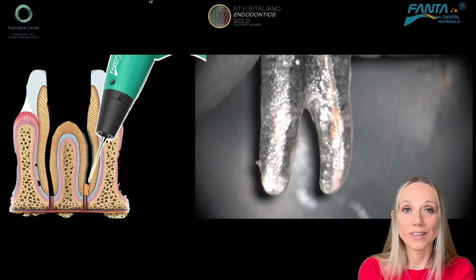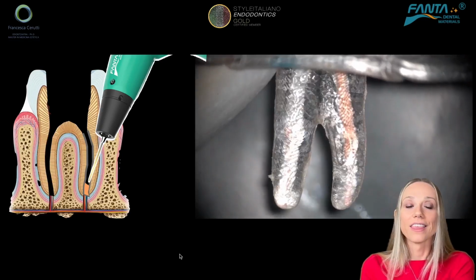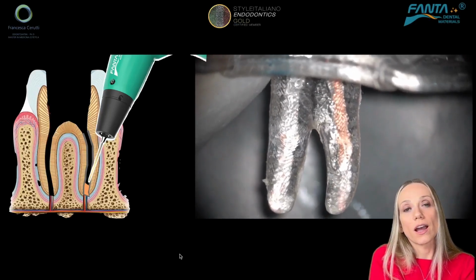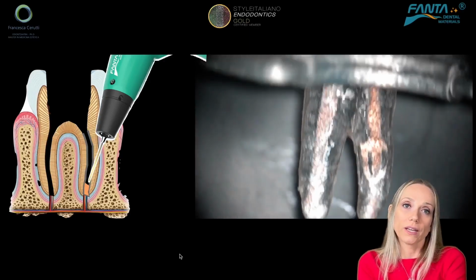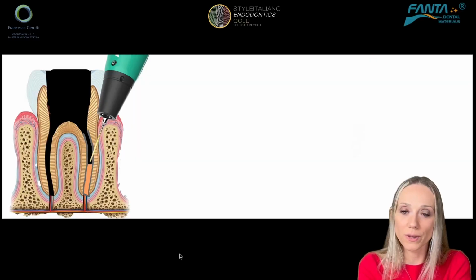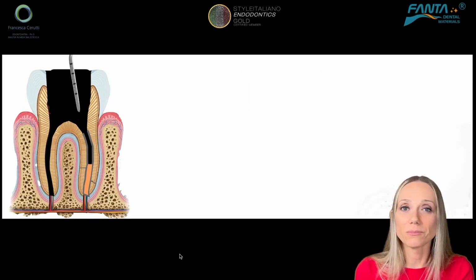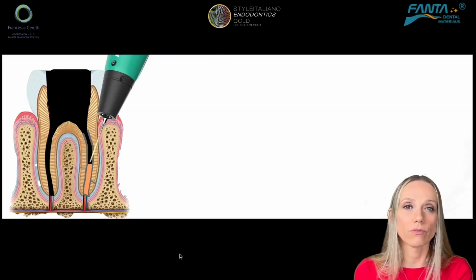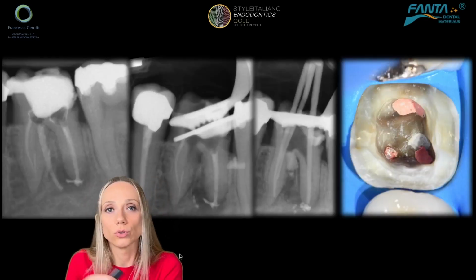So I take the heat filler, I heat it, I position it inside of the root canal, and then I extrude the gutta-percha. And while I'm extruding the gutta-percha, I take the e-filler out of the root canal. It will be pushed back by the gutta-percha that I extrude into that small space. And then I have to do it more times if needed, or if there is not so much space to fill, I can do it just one time. And after every passage, I take my hand plugger and I pack. And so I arrive to the root canal opening.